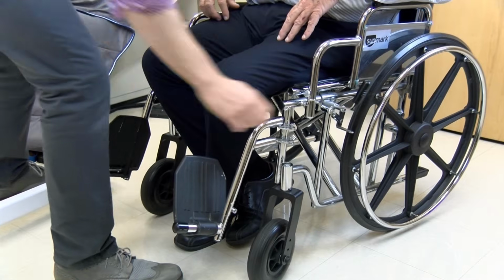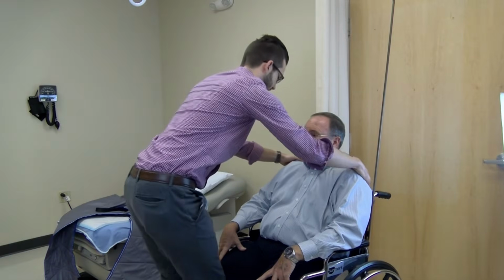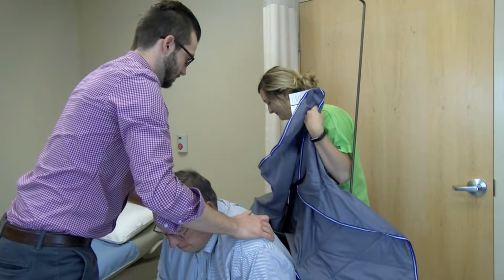Explain that you are going to place a sling under their body in order to help lift them using a mechanical lift to get them out of the chair and onto a table. Lock the brakes on the wheelchair and swing away or remove the leg rests. Ask the patient to lean forward. Be careful to not allow the patient to lean forward out of the chair. You may need someone to stand in front of the patient for this reason.